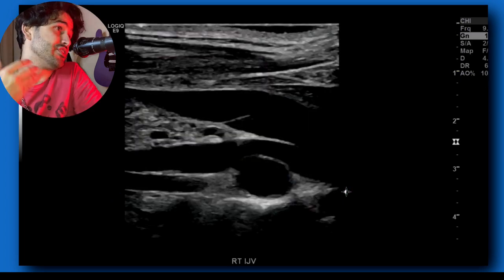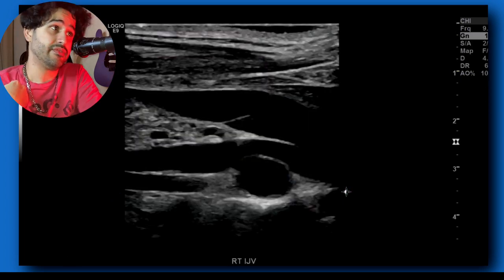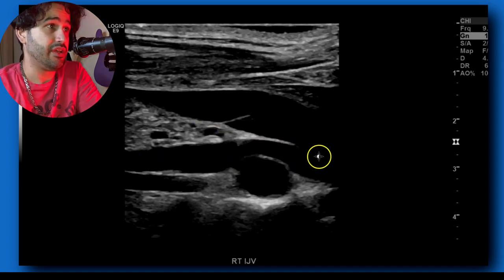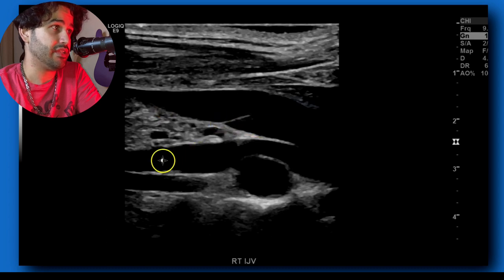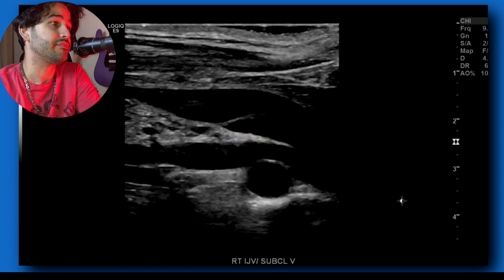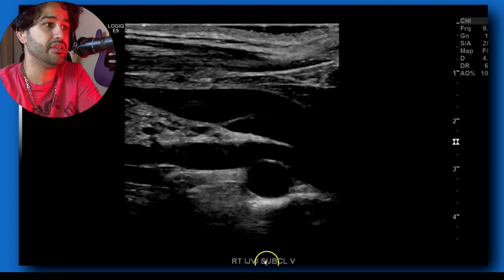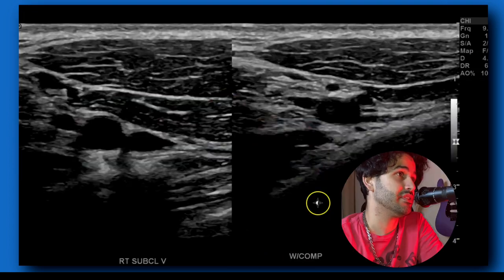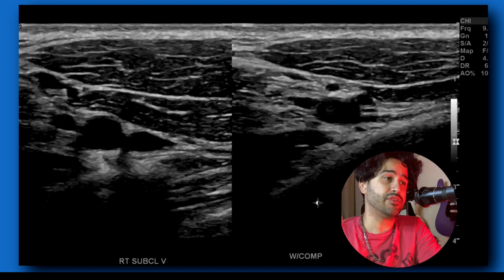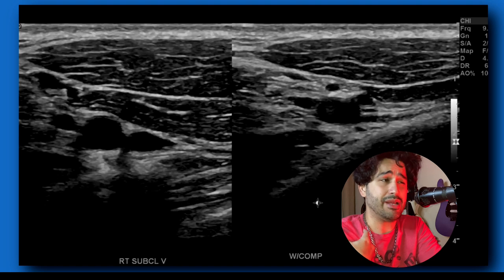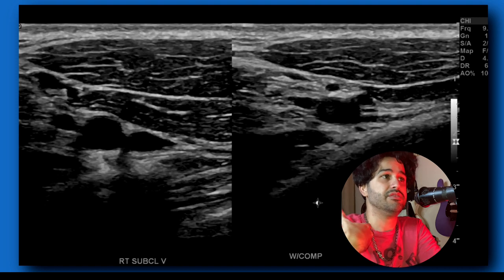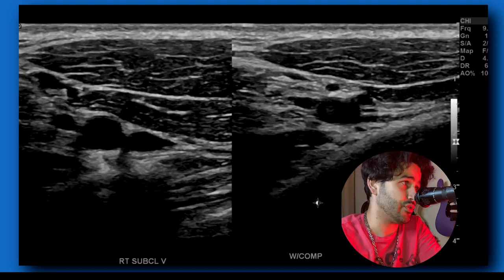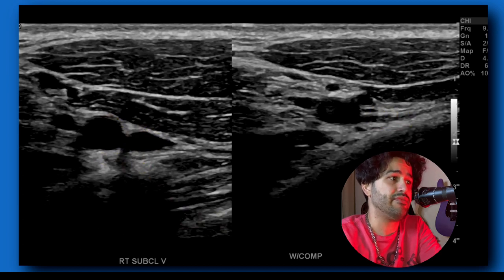Once you're done with the jugular vein, go down to the subclavian vein. In this patient you actually see the confluence of the jugular vein with the subclavian vein — here's your brachiocephalic vein, jugular vein, that's a valve leaflet, and this is the subclavian vein right here. You don't have to compress the subclavian, but if you can, do a dual screen and compress. Here I have a dual screen image of the subclavian artery and vein with the subclavian vein compressed.